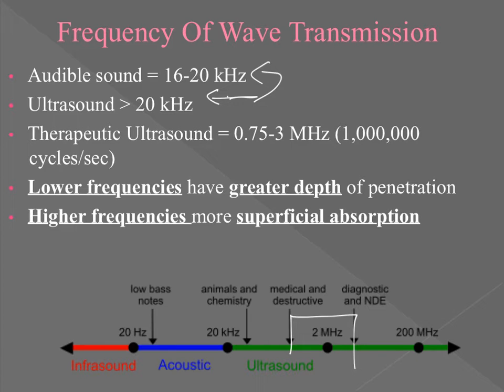I've already told you that ultrasound is capable of penetrating a lot deeper than most of the modalities that we've talked about thus far. But then we have to think about when we're setting our ultrasound, which of the settings is going to tell us how deep that ultrasound is going to penetrate, right? So look and track with me here, guys. We have lower frequency ultrasound settings and we have higher frequency ultrasound settings.